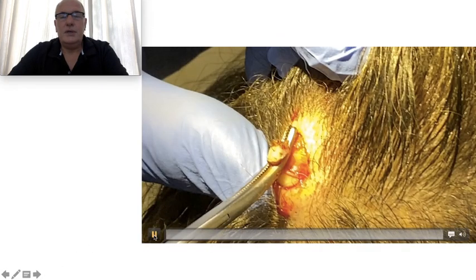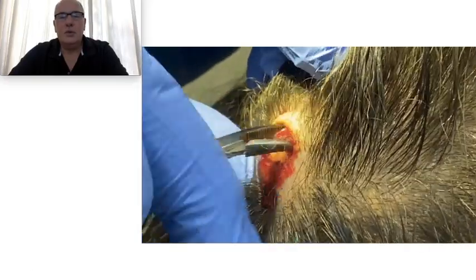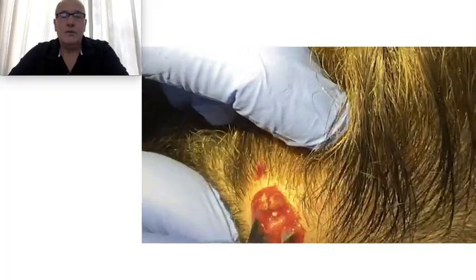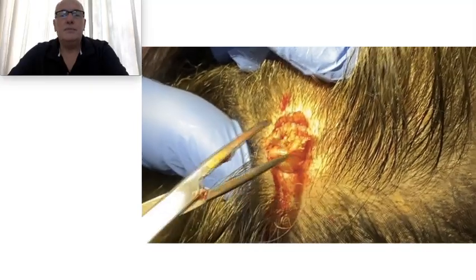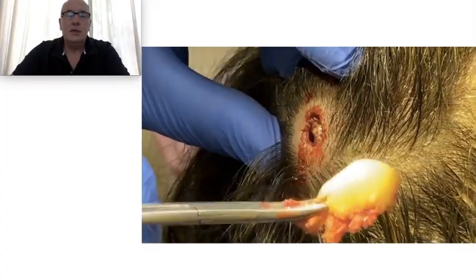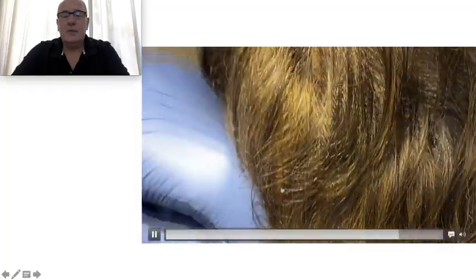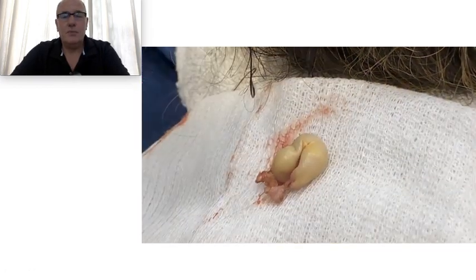Here I'm using an instrument to produce a dissection without any damage to the surrounding tissue. After I dissect the tumor from the tissue, I remove it in this way. Not blood at all, no damage to the surrounding tissue. Here we can see the strong capsule — with the removal of the cyst with this capsule, the patient is ready to go home.